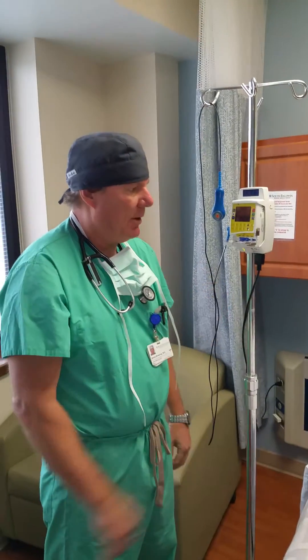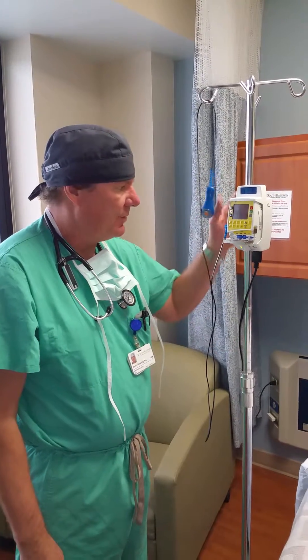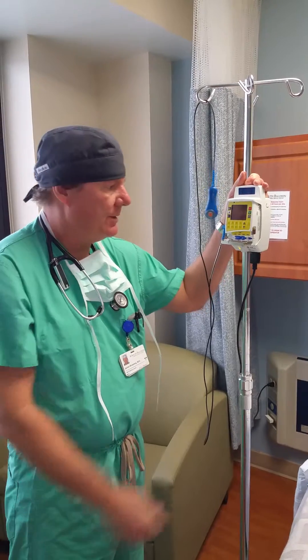This is a PCEA pump. PCEA stands for patient-controlled epidural anesthesia.